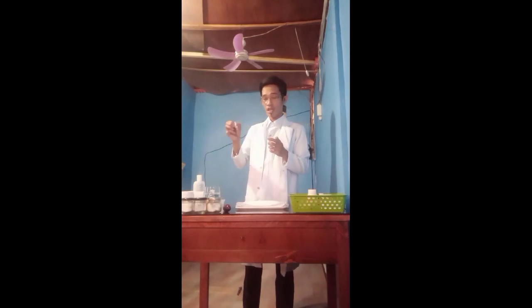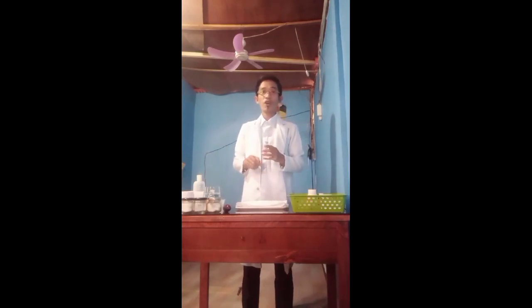I'm just twisting it to open. So it's already open. This part, the cup of the sterile water, you need to put in the waste receptacle.